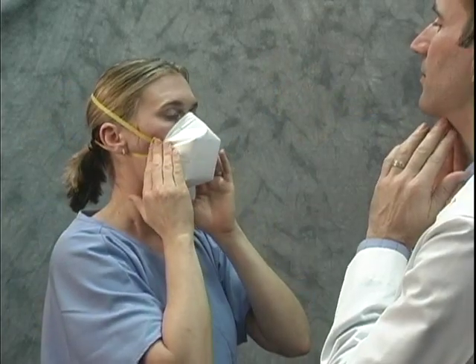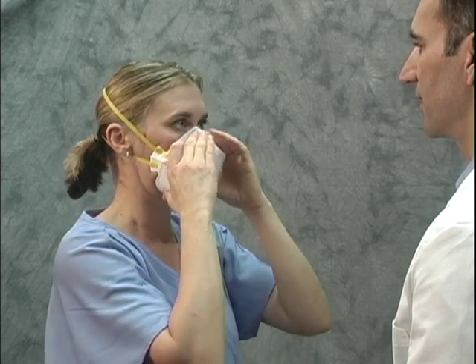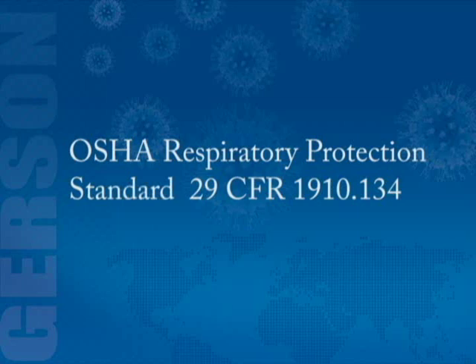The proper fit of your respirator must be confirmed with a fit test before you wear the respirator in a contaminated atmosphere, as part of an OSHA required respiratory protection program in compliance with OSHA respiratory protection standard 29 CFR 1910.134.